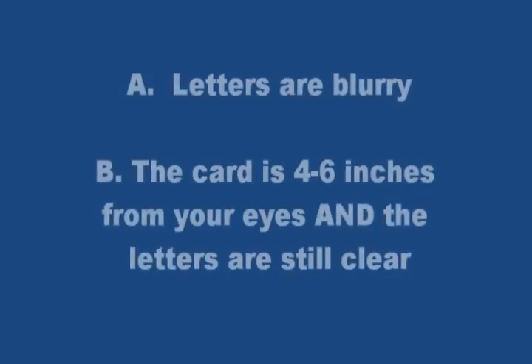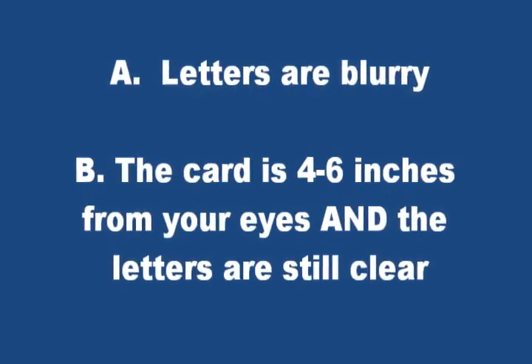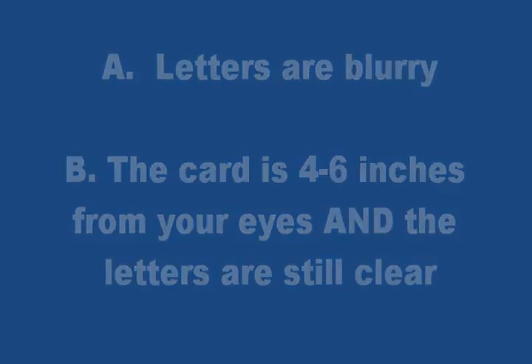closer to your eyes until A, the letters become blurry, or B, you have reached 4 to 6 inches from your eyes and the letters are still clear.